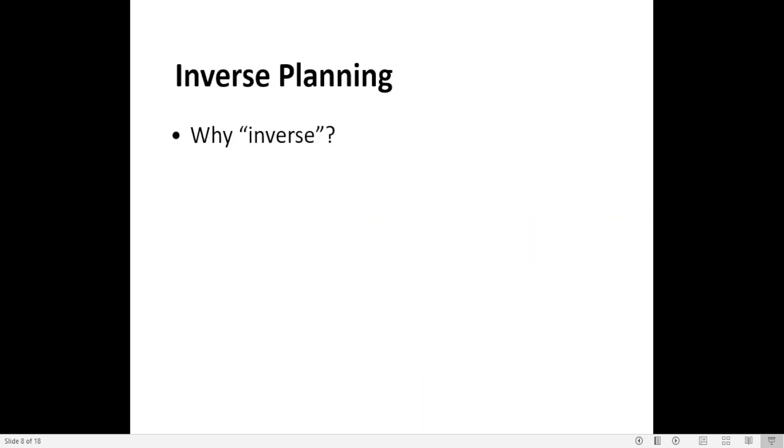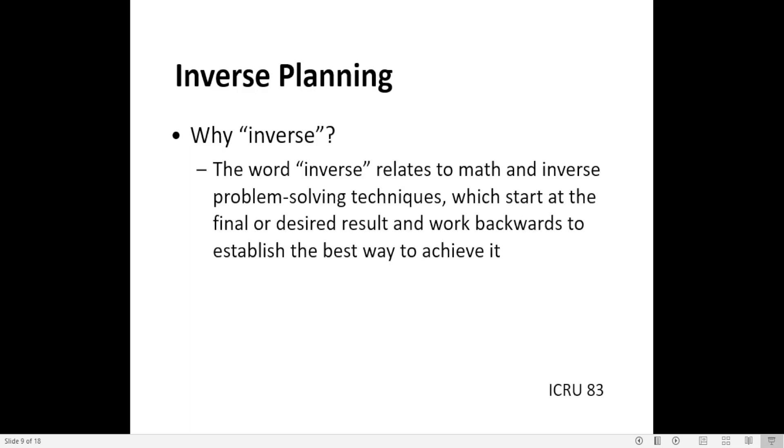Inverse planning. Why inverse? Why do they use the word inverse to start with? The word inverse relates to math and inverse problem-solving techniques which start at the final or desired result and work backwards to establish the best way to achieve it.